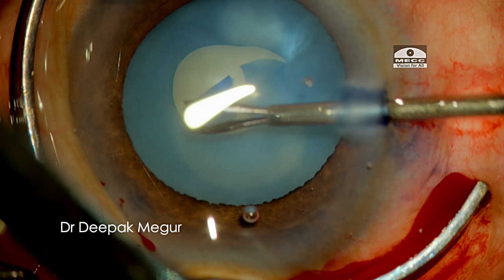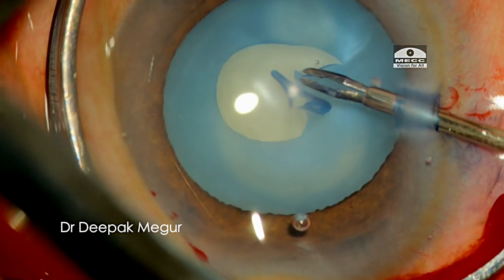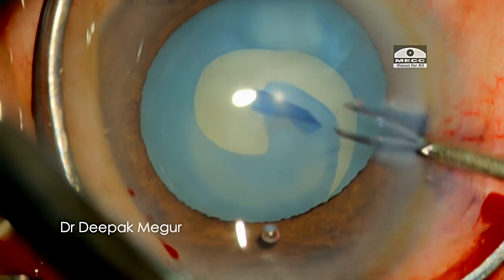A momentary lapse in concentration makes me ignore the warnings and continue. I try to perform the rescue maneuver, pulling towards the center where it is uncontrolled — and there she goes.